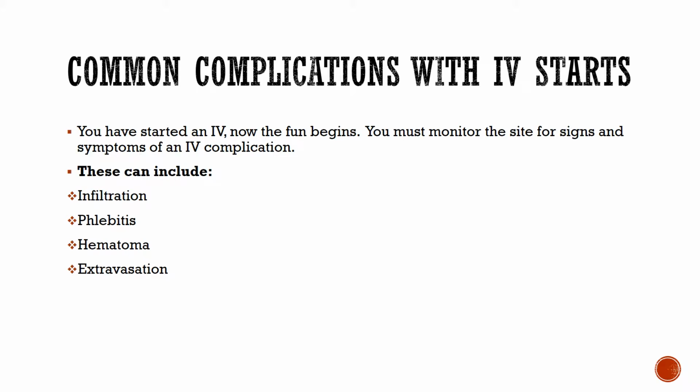The next topic we'll discuss is complications from IV starts. You've started an IV. Now the fun begins. You must monitor the site for signs and symptoms of an IV complication. These can include infiltration, phlebitis, hematoma, and extravasation.